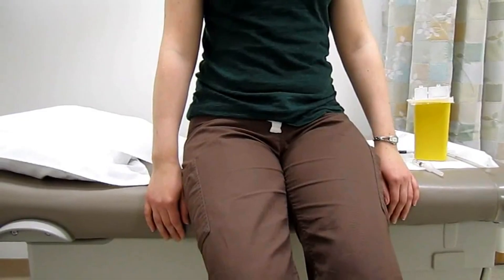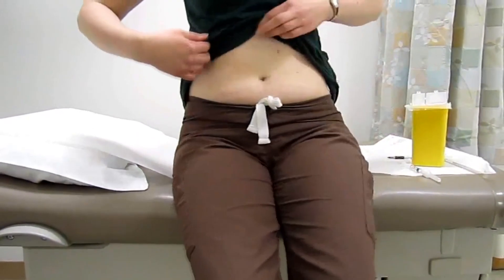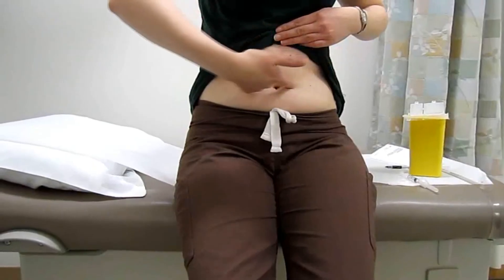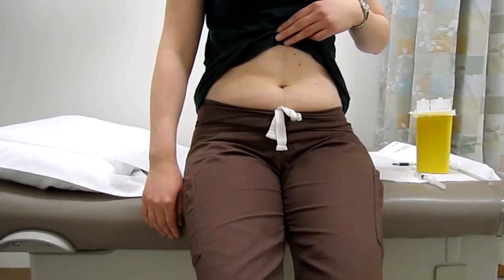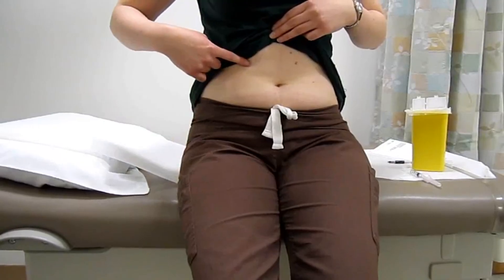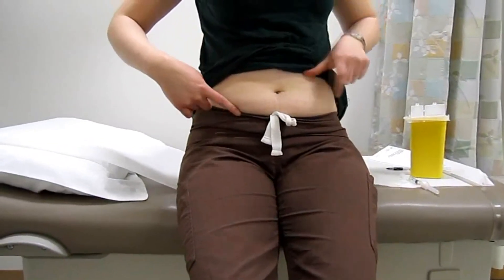To landmark your abdomen, you are going to use your navel as the center of your landmarking and draw an imaginary line vertically and an imaginary line horizontally. That has divided your abdomen into four quadrants: right upper, left upper, right lower, and left lower.